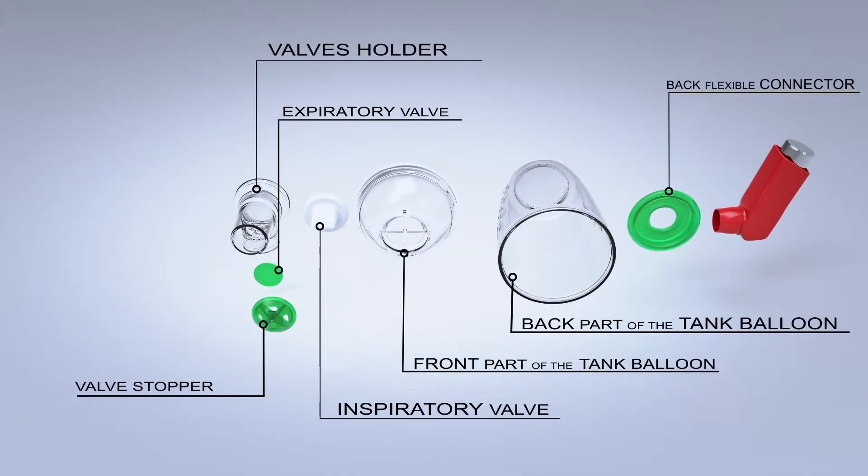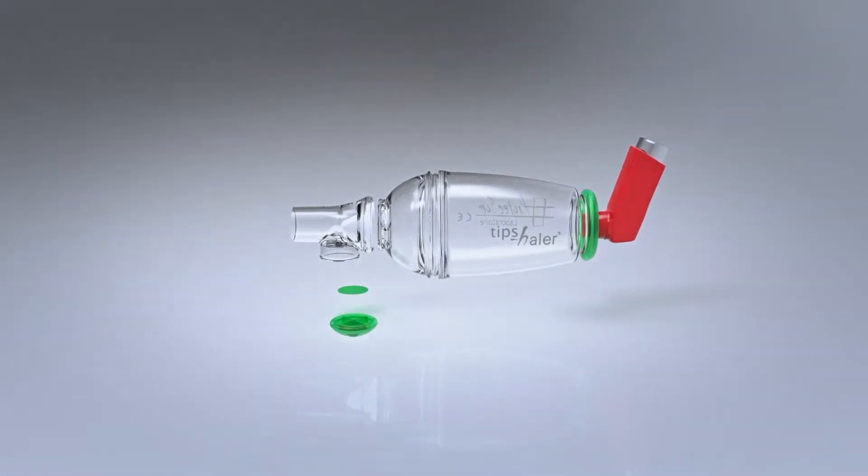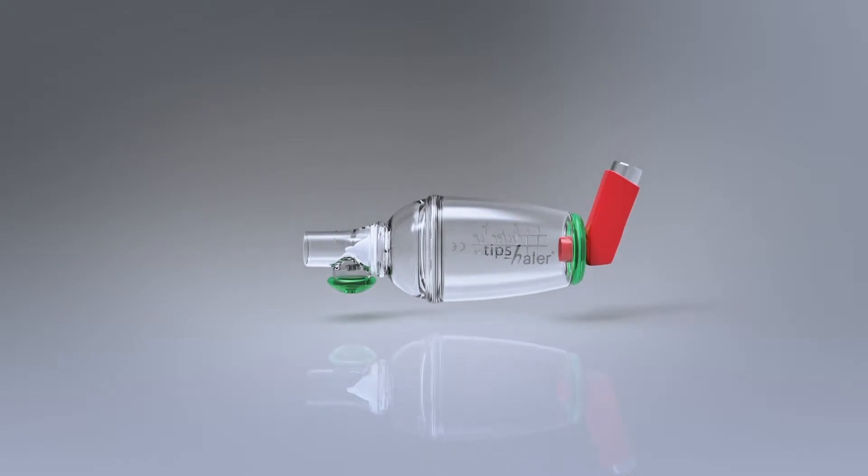Tipshaler can be easily dismantled. The patented inspiratory valve called ESOBRETH makes Tipshaler able to modulate the inspiratory flow and fits children's inspiratory flow. It's also useful for adults.